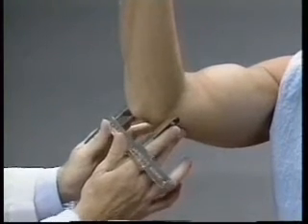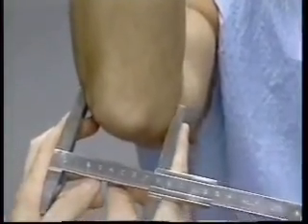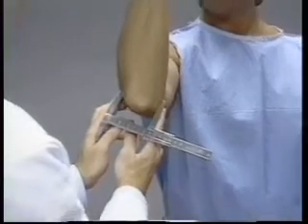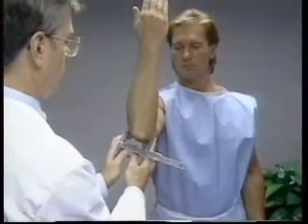The soft tissue is compressed firmly. This measurement is taken with the calipers at a slight angle because the medial epicondyle is slightly more distal than the lateral epicondyle. The greatest breadth across the epicondyles of the humerus is measured to the nearest millimeter.